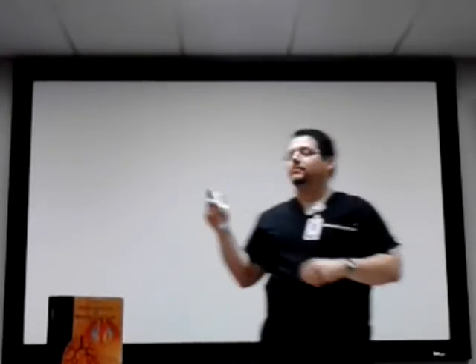Otherwise, after we have primed the medication, if you were taking it by itself, you would want to hold this about 1 to 2 finger widths away from your mouth, with your mouth wide open, and take the medication. After that, you want to breathe out, pretty much blow out your air. Go ahead and click it, and take a slow, deep breath at the same time.